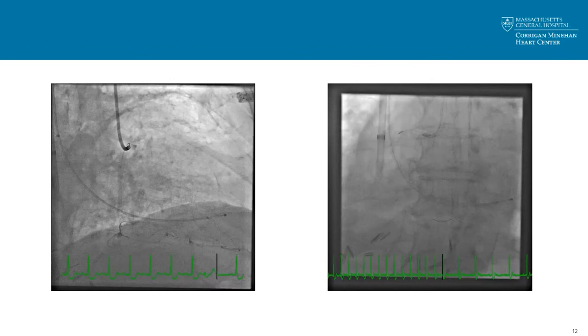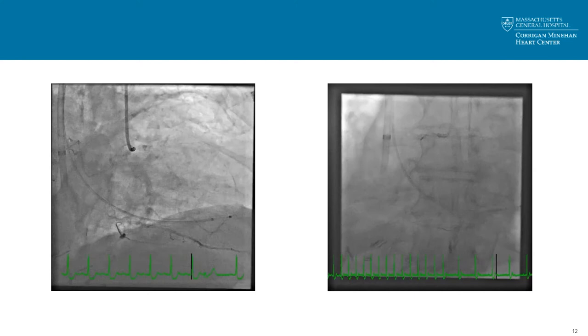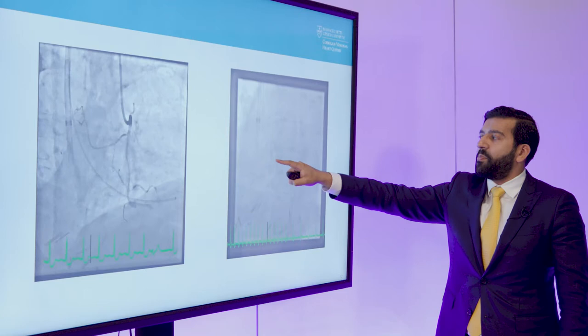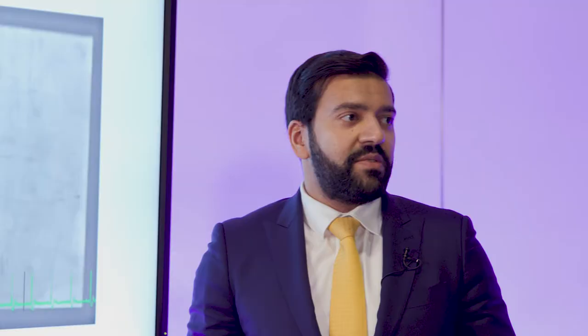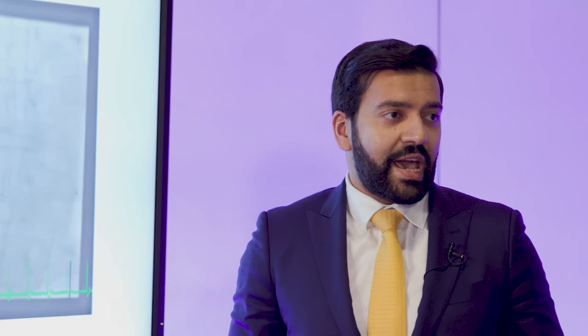Here again is the area we want to target — this is the rotational atherectomy we're doing. It's a 1.25 burr — a bullet shape, not a football shape — using small pecking motions as we get close to the lesion to make sure there are no decelerations. My starting RPM is usually around 160 to 170K; if I'm having trouble crossing, I increase to 200 or even 220K. We went at 170K, and the main thing is not to have decelerations less than 20K. We did several passes and were ultimately able to get through the calcium.